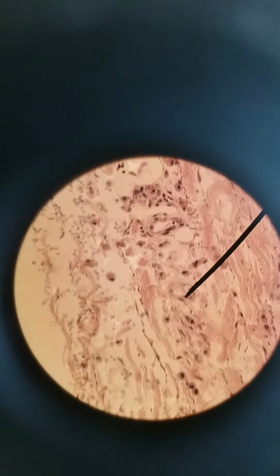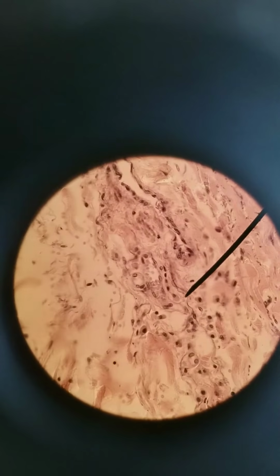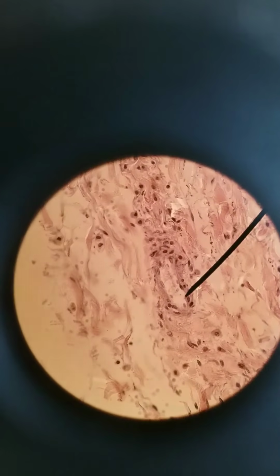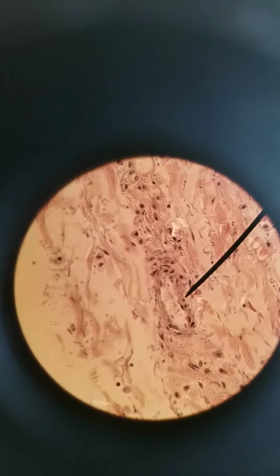Because we're in the aorta, one thing that we can find are blood vessels within tunica externa. Let me find a good small example like this one here. There. Okay. So you see this circular structure? This is a blood vessel. It's a capillary that's within tunica externa. Because blood vessels like the aorta are so big, they require blood vessels within this blood vessel. So there are capillaries within this really large artery. That's known as vasa vasorum.